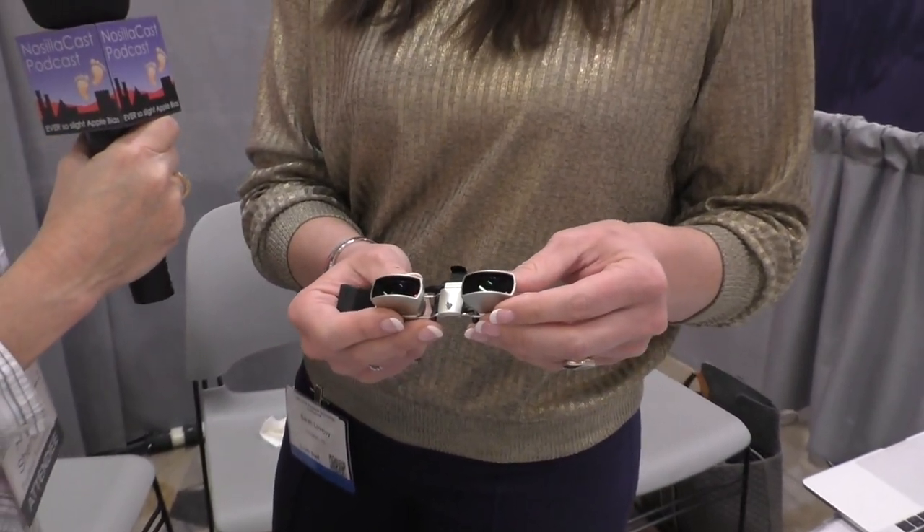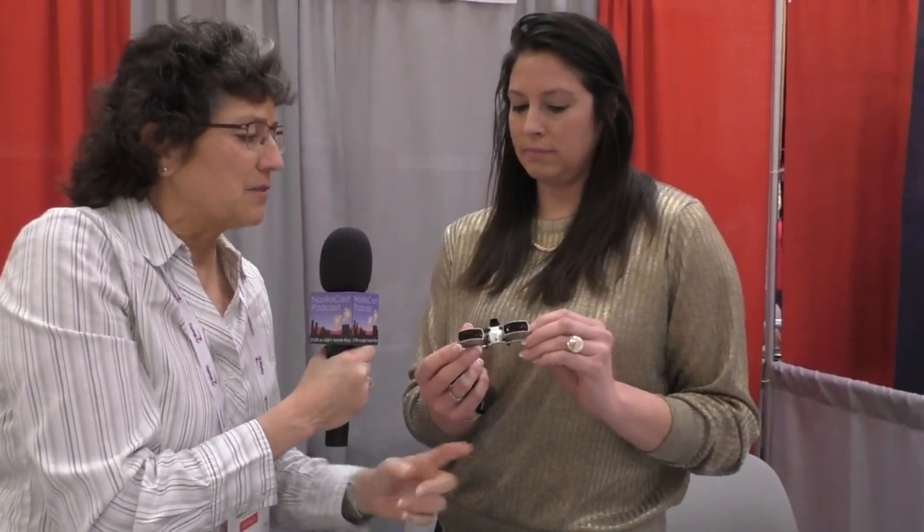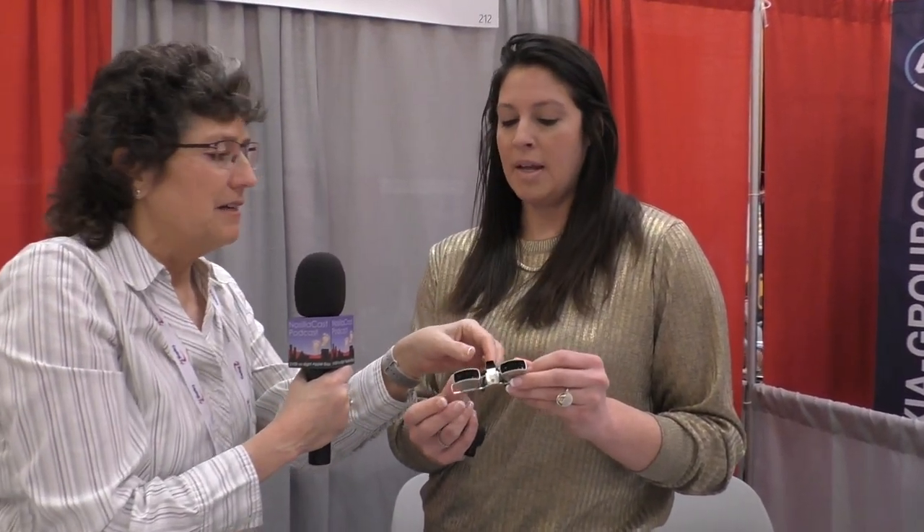We're going to describe everything for the people who are listening and not viewing. She's got something with two fairly wide-angle looking lenses on the outside, focusing mechanisms, and then it's a clip-on. What's amazing is how light these things are. You clip these on your glasses. This one is fixed focus.